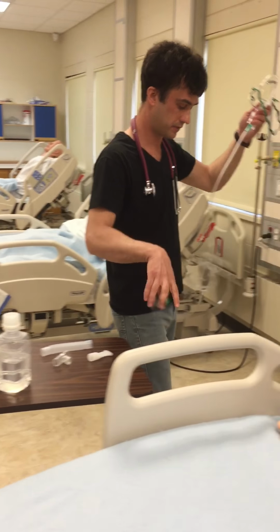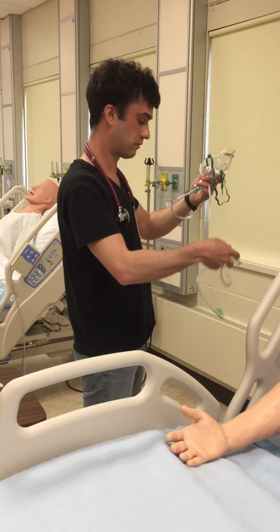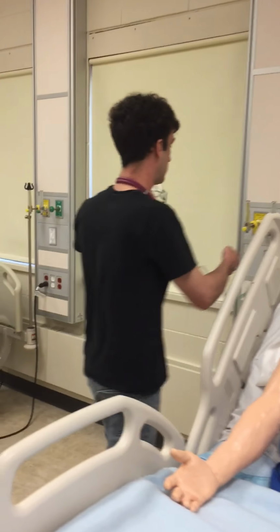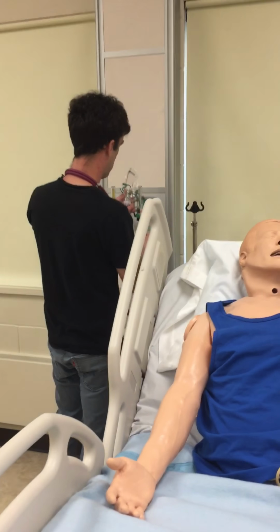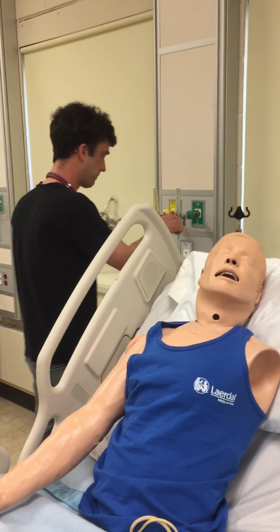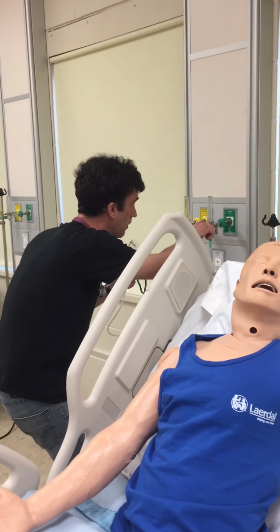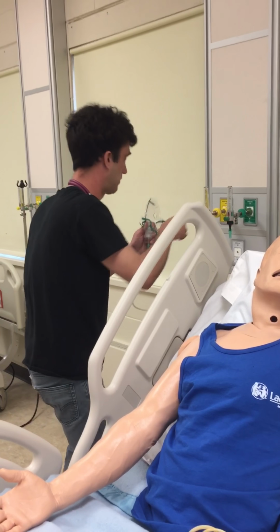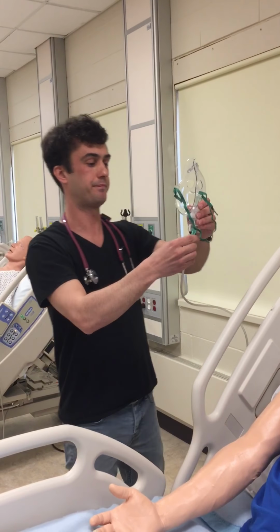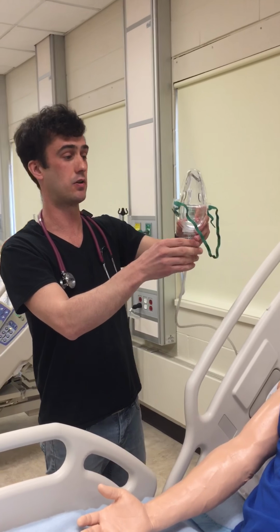I would connect the oxygen tubing to the flow meter on the wall and set it to the proper flow rate, which is between 6 and 8 liters per minute. I would make sure that the device is working properly by checking for the presence of aerosol.